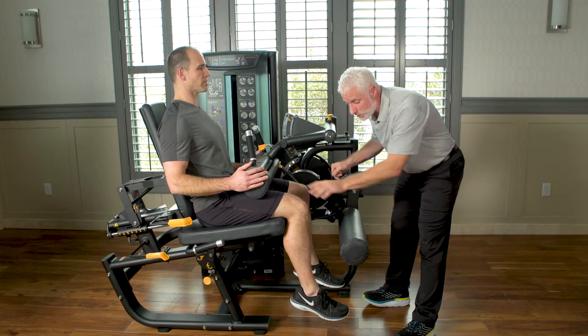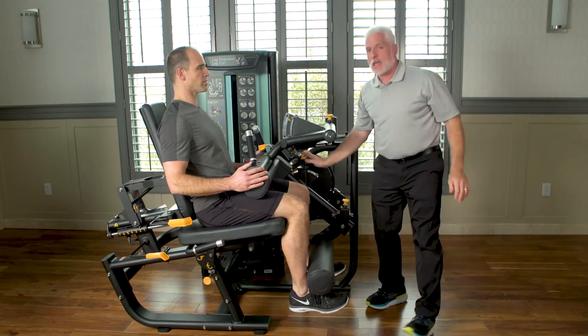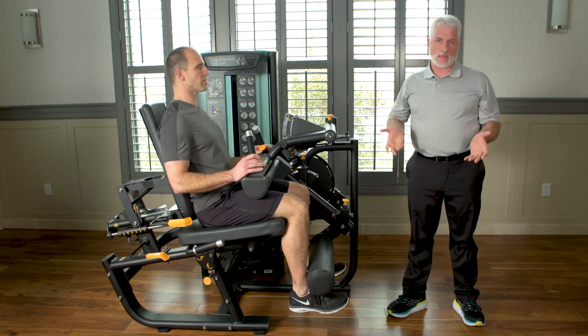Because we're going to work the quads, we pull this down here very easily, and then we can get ready to work with this patient depending on what their pathology is.